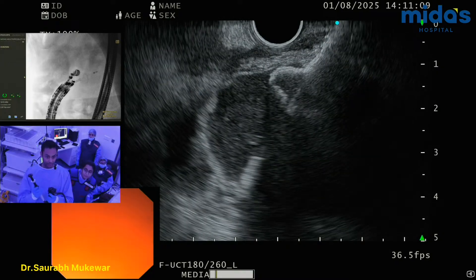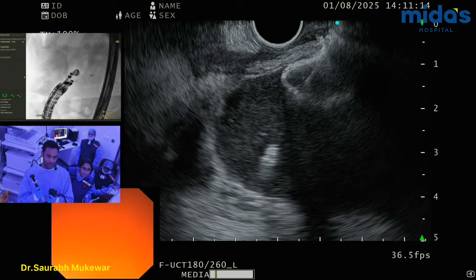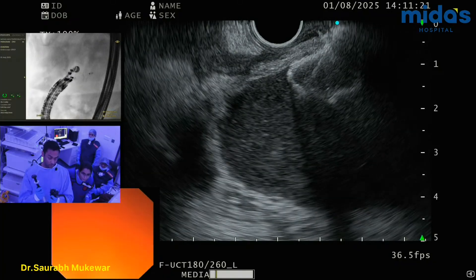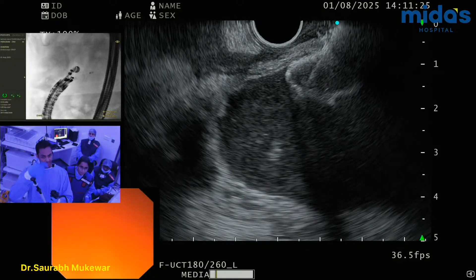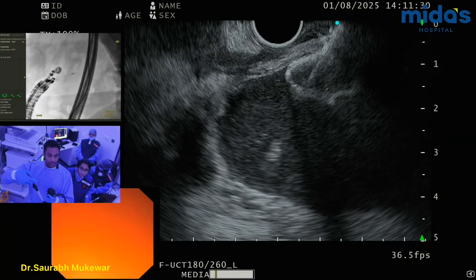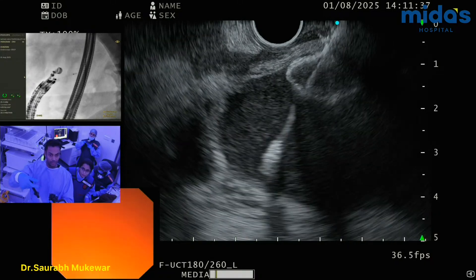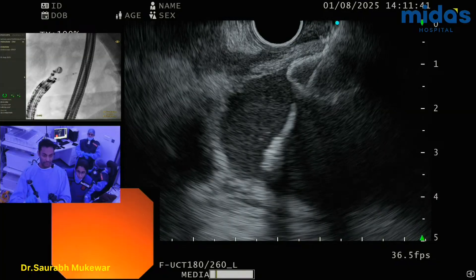Now we have to get the stent into position. So, you're looking at the screen — it's there. Then I'm going to pull it up. Now I've got a decent access. It's a little obtuse. This much is enough. And I'm going to stop here and lock this thing. The reason I'm doing that is because it's a thick wall — it's almost one centimeter at that area. Now I'm going to do the intra-channel deployment. Lock this so that you don't mess up. This is the intra-channel deployment. I'm going to go ahead and deploy. Done. Intra-channel done. Stent position not changed — it's in locked position here.